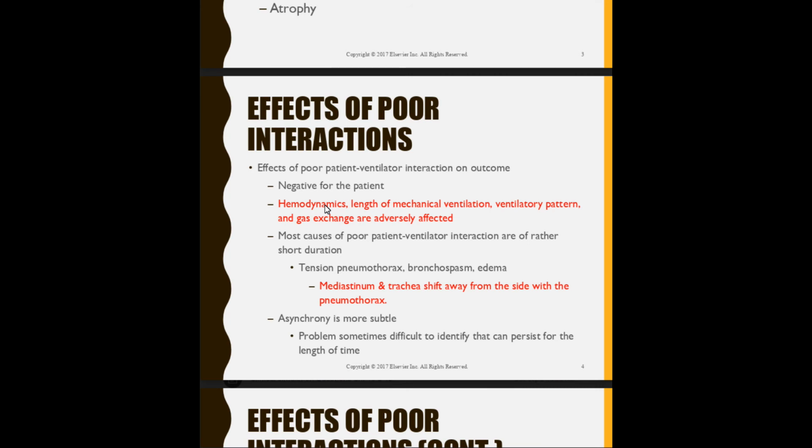Now, it can, and that's one of the dangers about it, because it can happen over a short time, and then it'll just be done. So your ventilator might trigger an alarm, and then all of a sudden it'll just stop. So you hear the alarm, you get up, and all of a sudden it stops. And so now you're sitting here like, huh, okay. And you sit back down, you start charting, you hear it go off again. You stand up, and it stops.